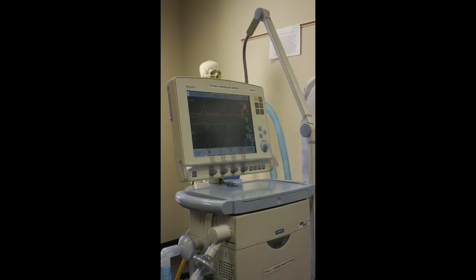And at the other campus, I actually made pretend red outlets. I put little red things so you can just get in the habit of making sure it's always plugged in there. Why do we need to plug it into a red outlet? The power goes out to the generator. Yeah, those are the outlets that are powered by the generator. So you always want to make sure you got an ambu bag with mask in the room.